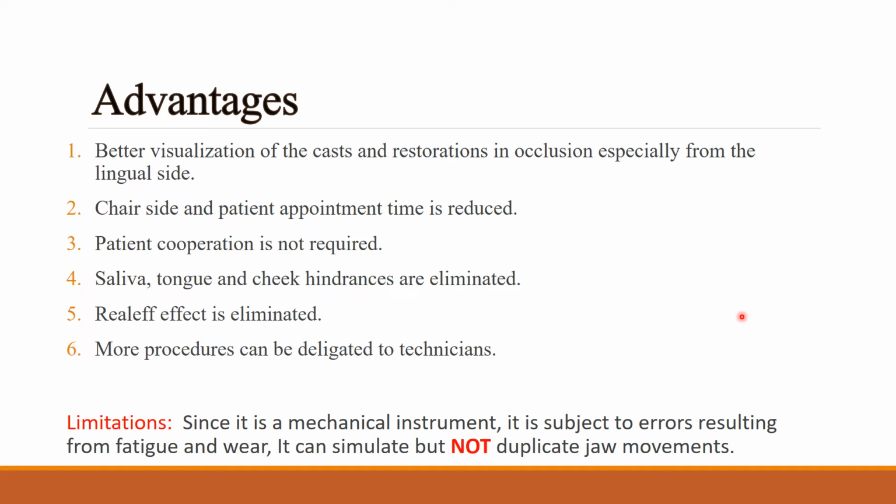Okay, so coming to the advantages, there is better visualization of the cast, restoration and occlusion, especially from the lingual side. This is an excellent point. Whenever you all come and show me the work, I have to see the lingual side of the occlusion, which is a little difficult to see in the patient's mouth.